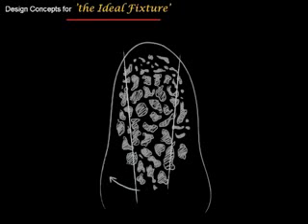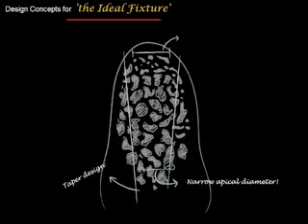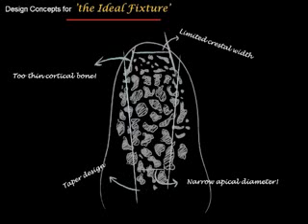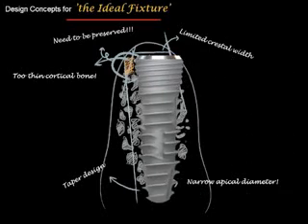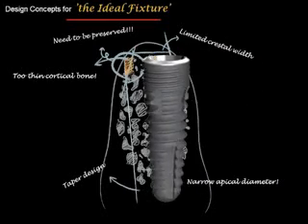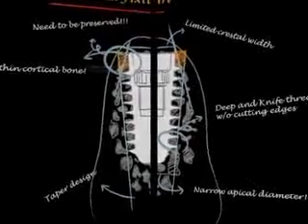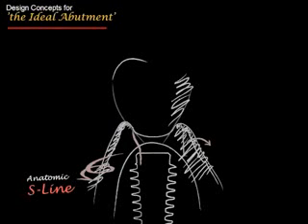Let's look at the different design concepts for the ideal fixture just in general. If we could draw a blackboard and just have a brainstorming session and go, what could we dream of for the ideal implant? You see thus the crestal bone patterns up top. Every implant that's coming across here, as we analyze them, is compromising the crestal bone. So the AnyRidge system, with the very unique thread patterns, gets amazing primary stability, but it does not compromise the blood circulation as well as crestal bone at the very crest of your ridge.